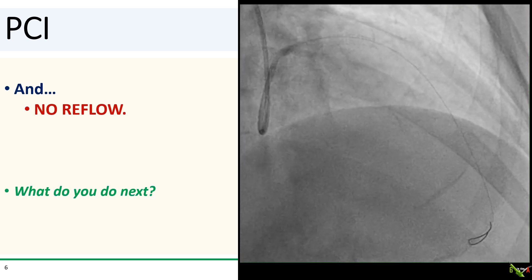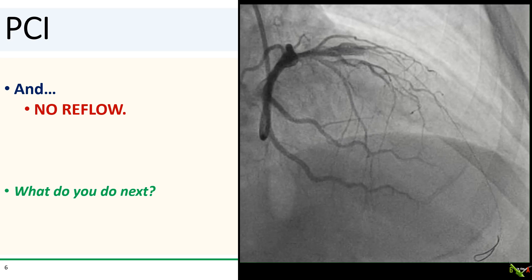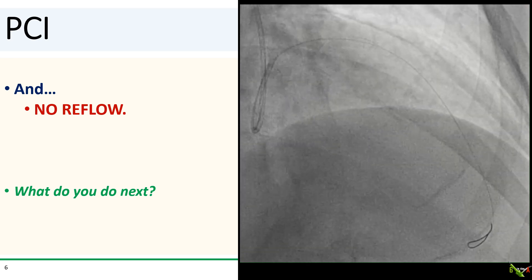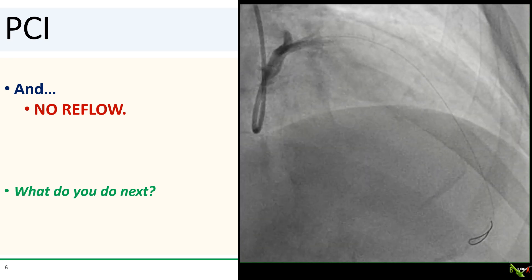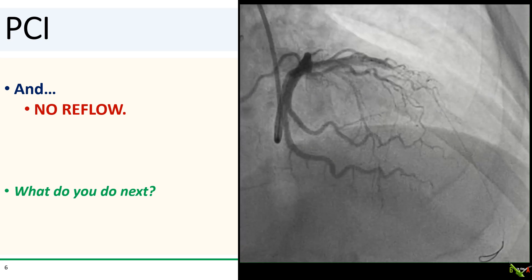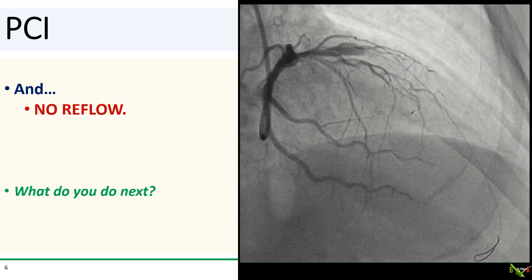We take a quick look before post-dilating, and the LAD is occluded again. We have no reflow. What do we do next?